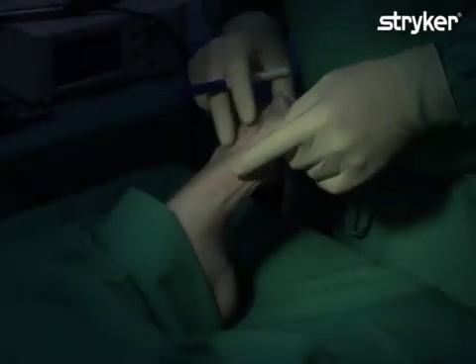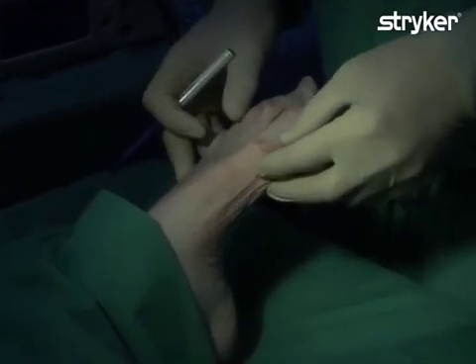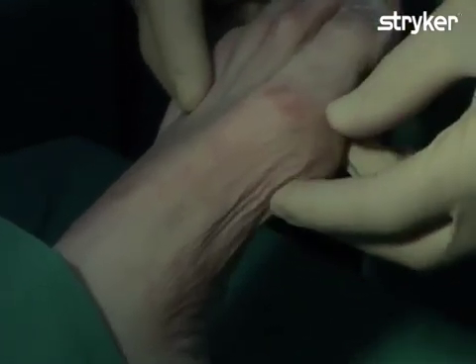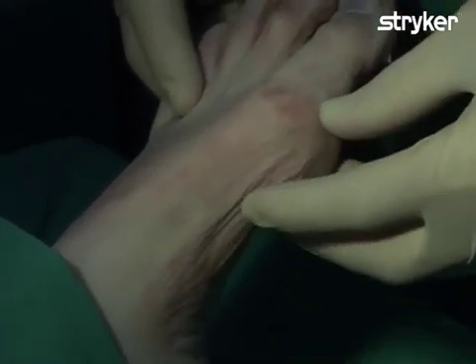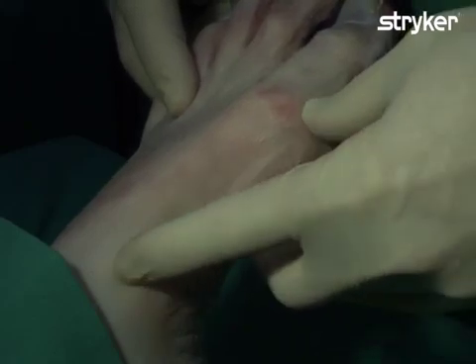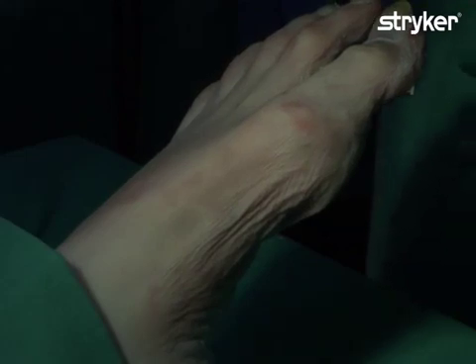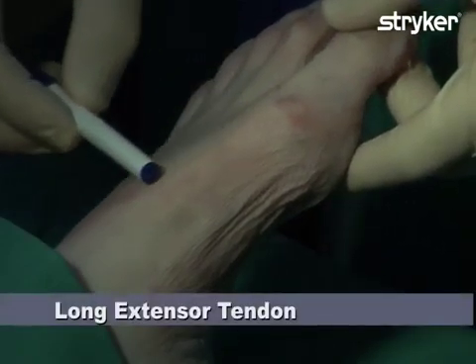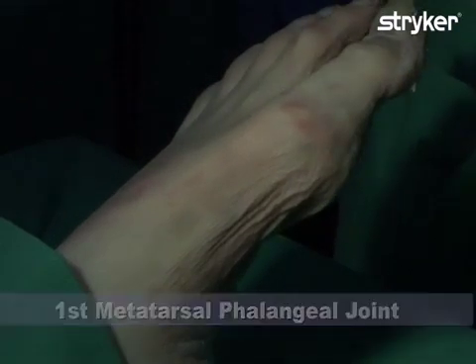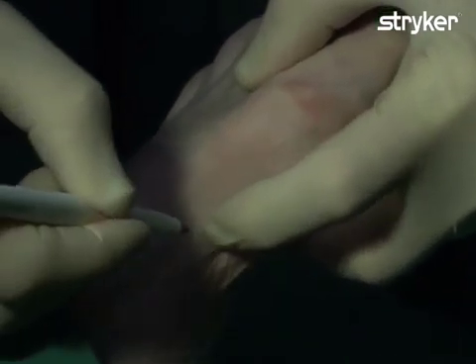In this procedure we will demonstrate a surgical technique used to correct a hallux valgus deformity, referred to as the Lapidus procedure. In the Lapidus procedure, the first metatarsal will be fused to the medial cuneiform. The anatomical landmarks are the long extensor tendon, the first metatarsal phalangeal joint, and the first metatarsal cuneiform joint.